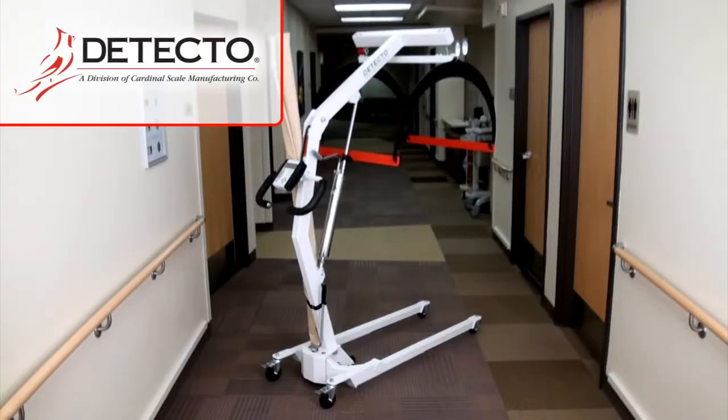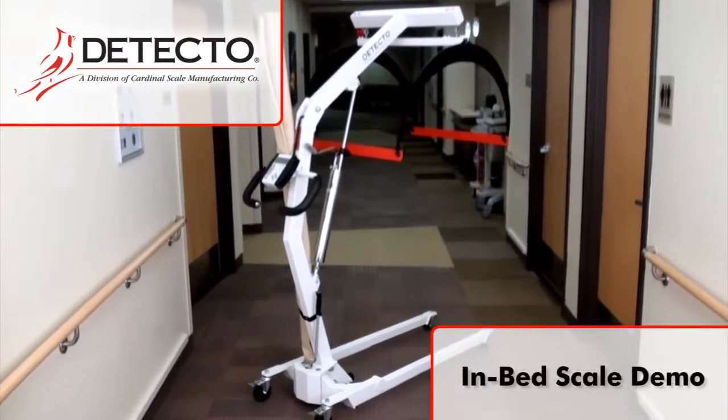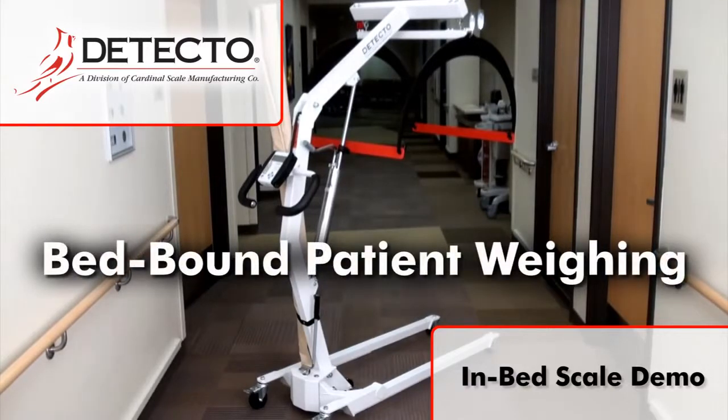This video will demonstrate the proper method of weighing a bedridden patient using a USA-made Detecto in-bed digital scale. In order for an accurate weight to be measured, the tare weight of the stretcher must first be taken.